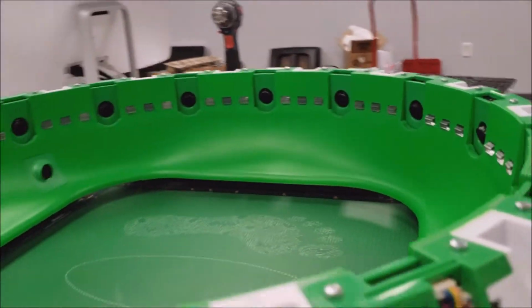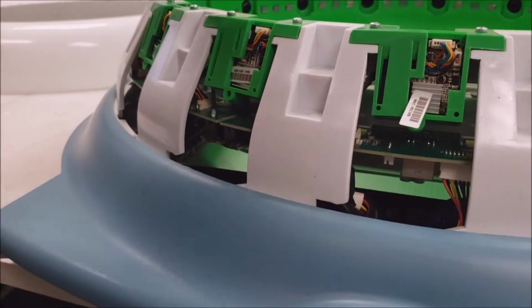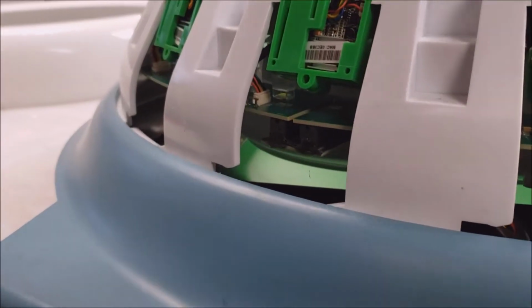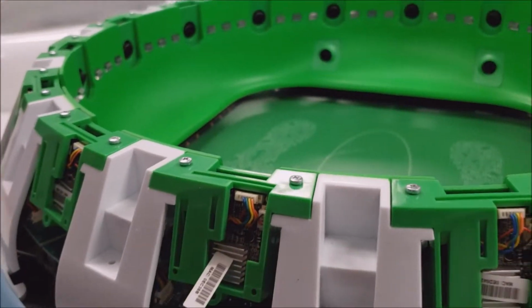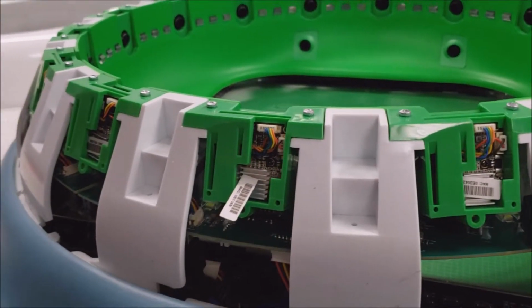It's important that you make sure that all these connections are secure, for the purpose that when you start up the scanner and you turn on the software, you're going to have all the lights in multiple colors flashing around. That means everything's successful at that point.